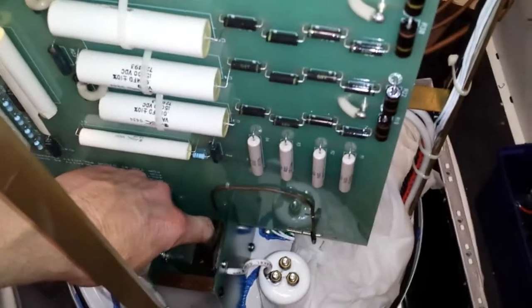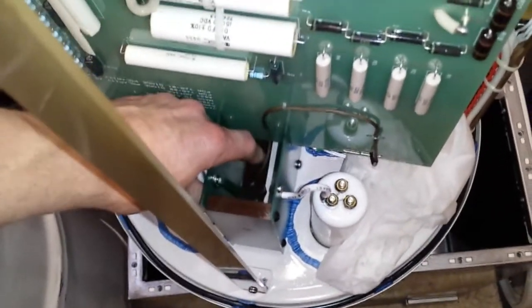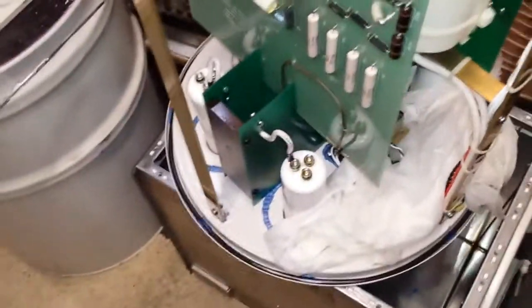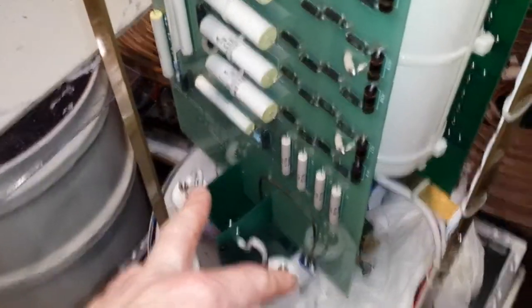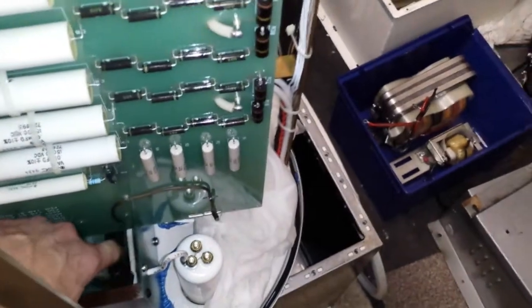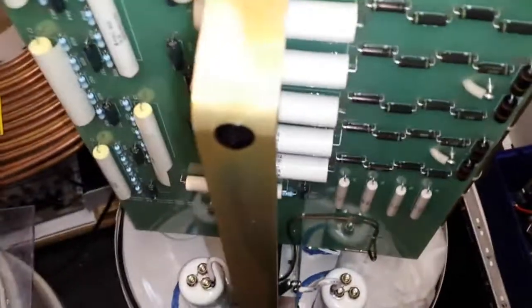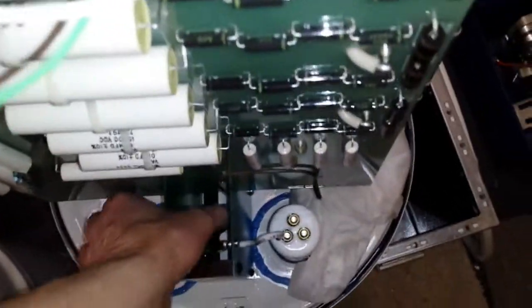Oh, I forgot to show you this actually. Here, it switches from side to side, whether those two or these two. So how it looks to me, the reason why you've got to switch in between the two sides is probably to do with two machines off this. It's pretty good though, how that works.